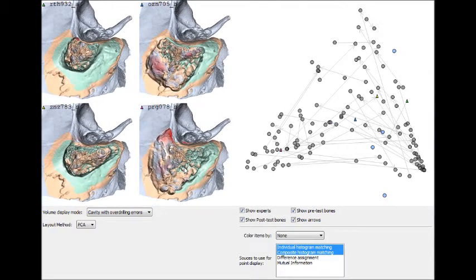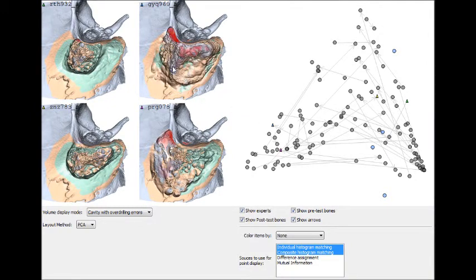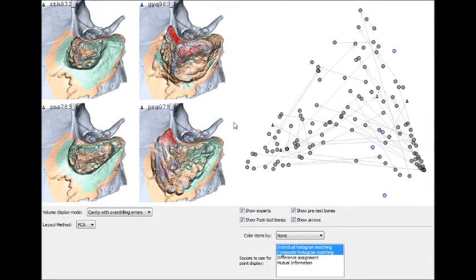Here you can see how data items located near each other in the scatterplot display show commonalities when shown in the volume windows.